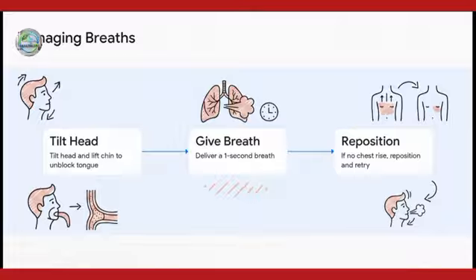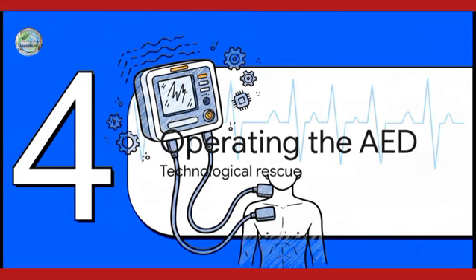Second, deliver a breath that lasts just 1 second. Don't breathe too fast or too hard, or the air is going to bypass the lungs, enter the stomach, and make the patient vomit. And third, if the chest doesn't rise on the first try, just reposition the head and try again. All right, Section 4, Operating the AED. We're getting into the technological side of the rescue now.